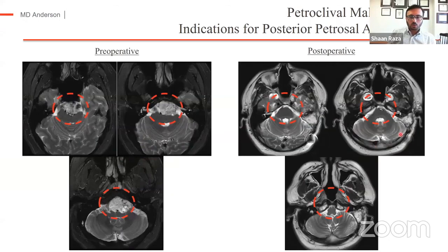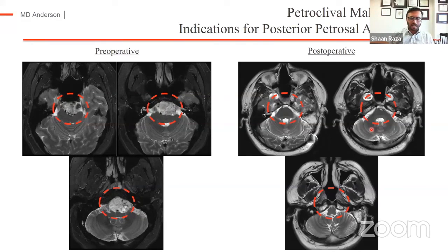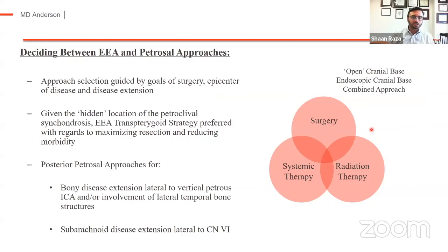With the combined petrosal approach, I can see the retractor on the petrosal surface of the cerebellum, the lower cranial nerves, and the PRAS probe on the vestibulofacial complex with tumor in that interval. I dissected the porus trigeminus, the trigeminal nerve all the way out anteriorly, the superior pole of the tumor up against the basilar apex. The tumor was completely resected with the ipsilateral vertebral artery in view. On the pre- and post-operative scans you can see a complete resection. The patient had a partial sixth nerve palsy that resolved about three months after surgery. I included this case to highlight that while there are cases where you hope to succeed endoscopically, knowing you have the backup of a lateral combined petrosal approach is helpful so that you don't push surgery too far, but still achieve the best result for the patient.